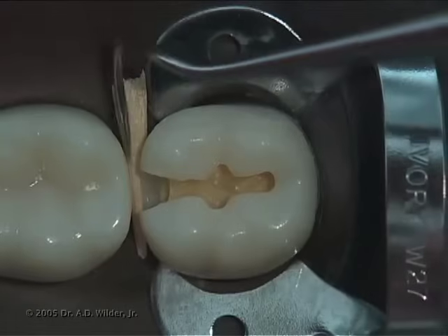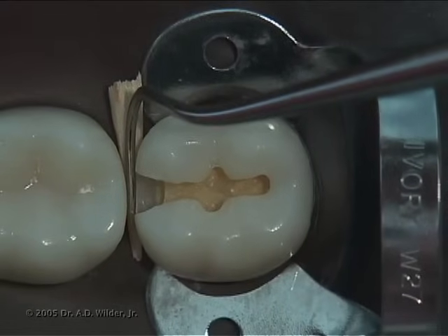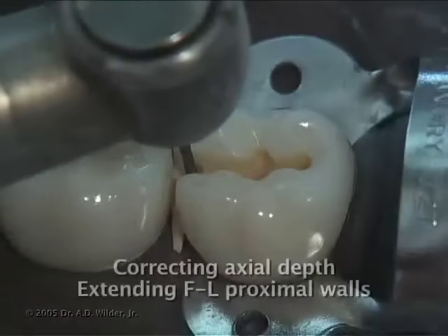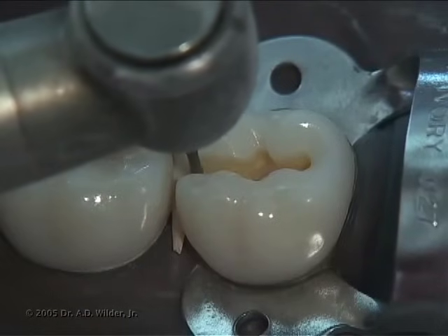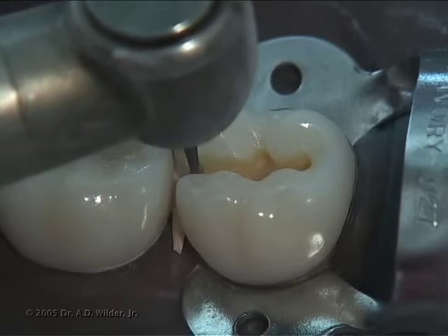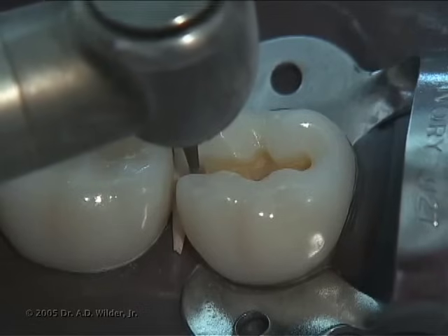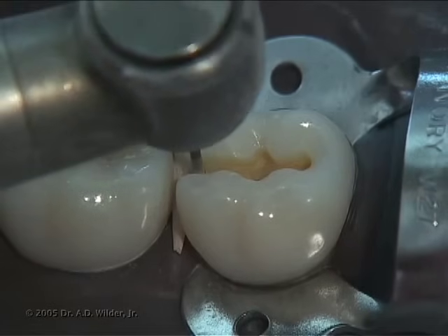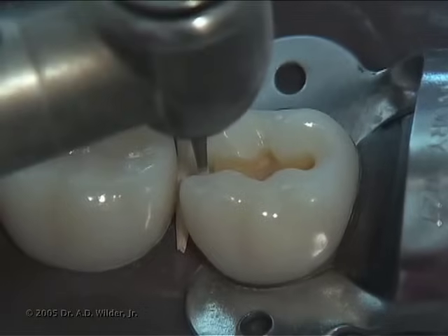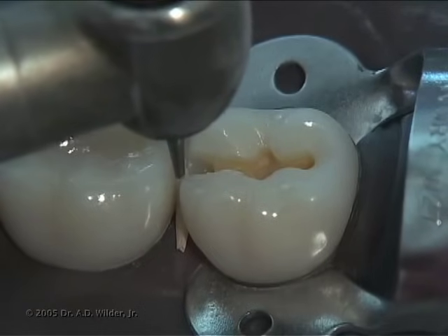Check with an explorer that you have clearance between your prep and the adjacent tooth, although take note that a wedge will make the clearance seem more than it actually is. Go back and correct axial depth and extend the facial and lingual walls as needed. Remember, we want around 0.5 mm of clearance facially, lingually, and gingivally to provide the best possible matrix band placement and ultimately proximal restoration.